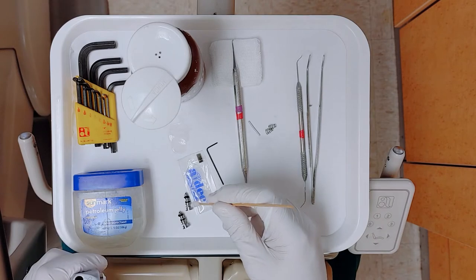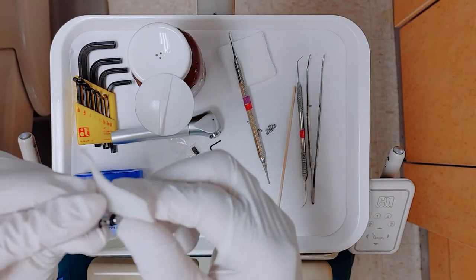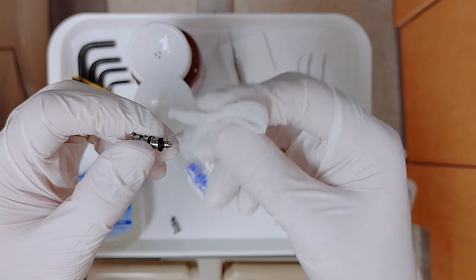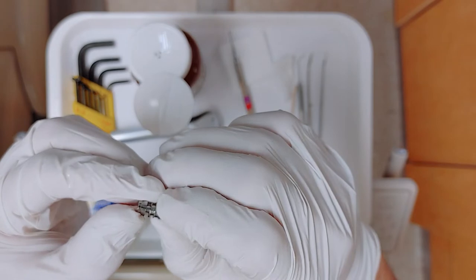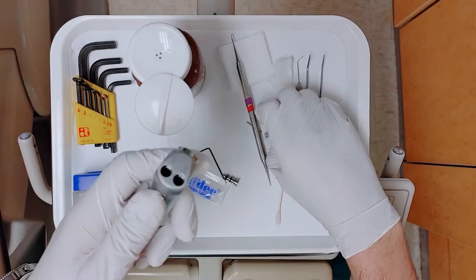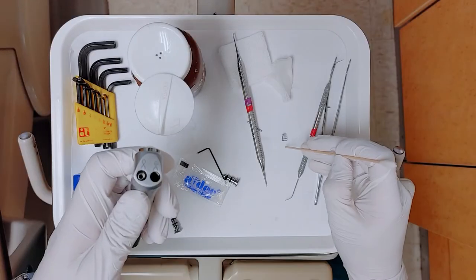But as I go over to my buttons and get those cleaned out really good, you might find a different problem. So I can take a look. It looks like there's still a lubricant on here, so I don't need to clean these up with my alcohol 2x2. But I'll give this a nice little twist and try to get all that gunk out. See if anything's left in between this little piston rod, make sure it's nice and clean, and hit it up with my lubricant as I need to.